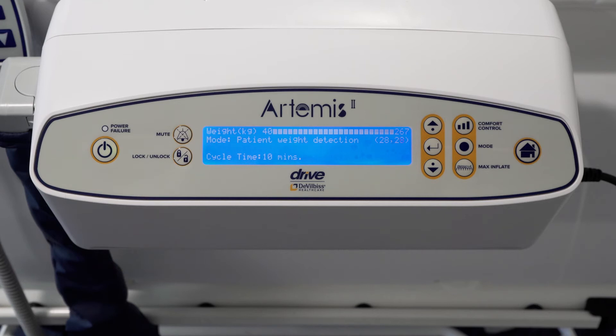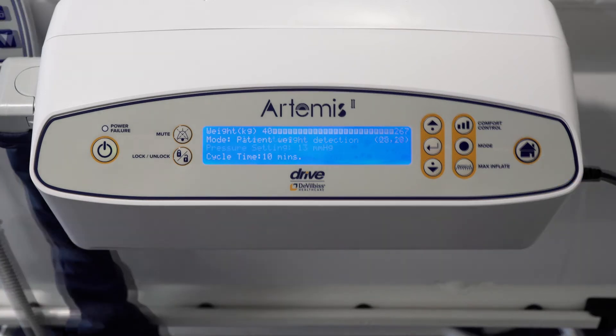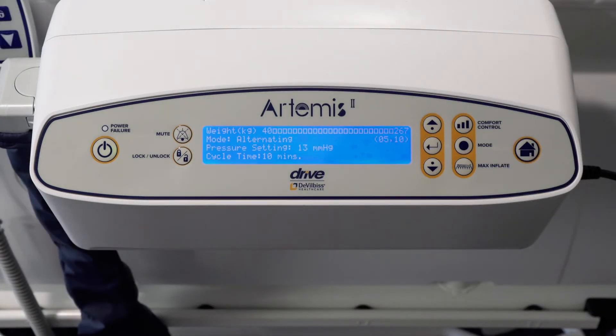There is a visual weight indication display — this is for guidance only. The patient weight will be assessed every 60 minutes. The minimum weight is 40kg and the maximum weight is 267kg. Each square represents 10kg. There is also power failure illumination, a lock and unlock function, and a mute alarm button which silences the audible alarm for 20 minutes. The home button returns you to the home screen. The digital screen will inform the carer of the chosen mode, the cycle time, and the internal cell pressures.